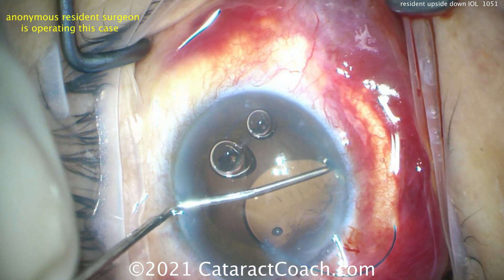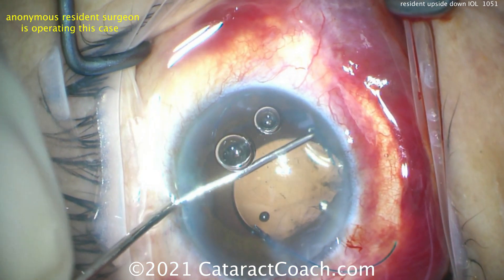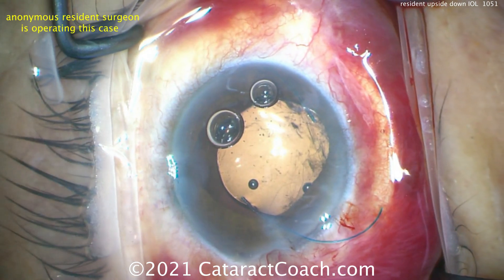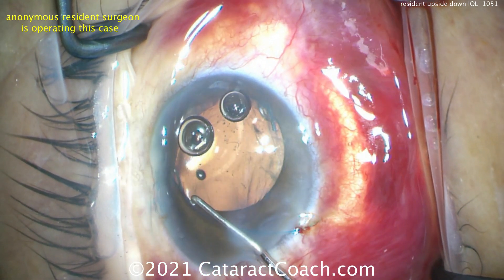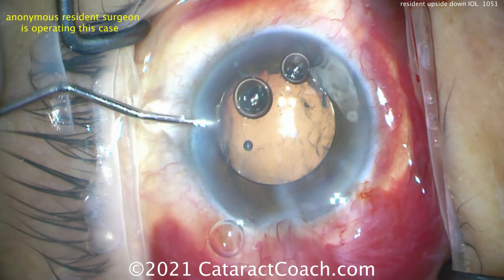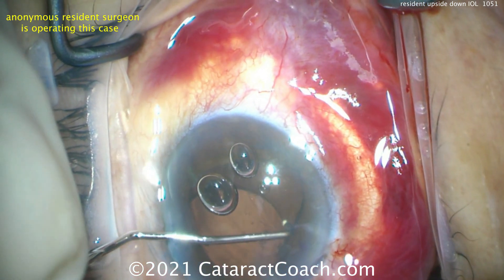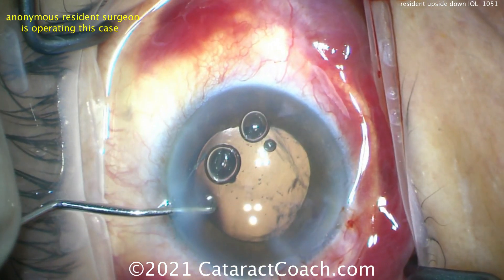There was a reasonable refraction — a little more myopia than expected, because this lens was originally intended to go in the capsular bag, but now it was in the sulcus. The rhexis was such that an optic capture could not really be performed. Now let's dial this into the sulcus nice and easy, keeping the anterior chamber full of viscoelastic so we don't get damage to the anterior hyaloid face — you don't want vitreous prolapse.